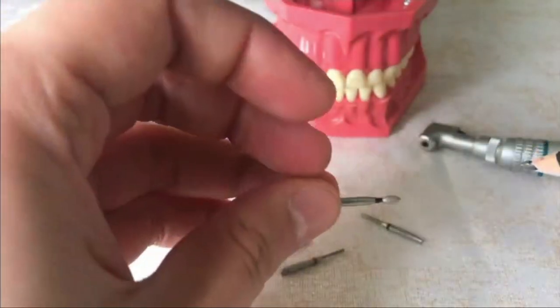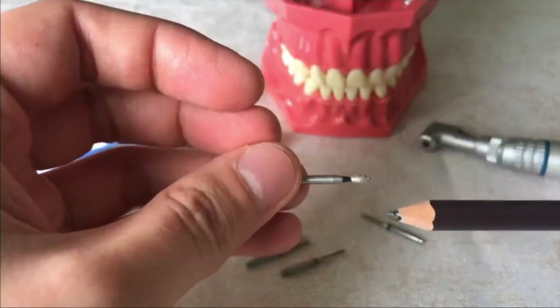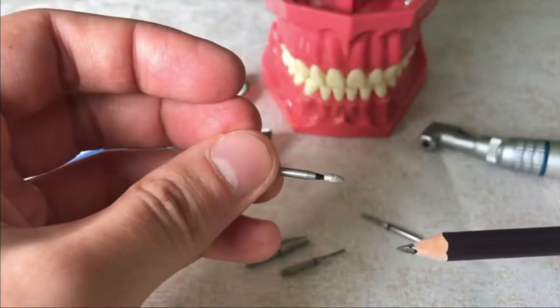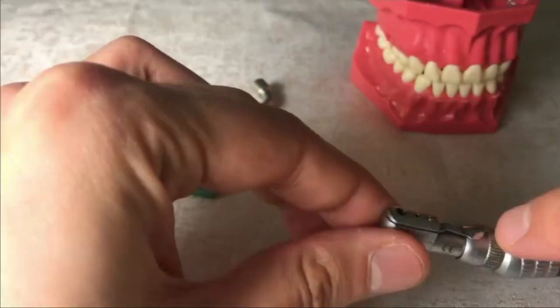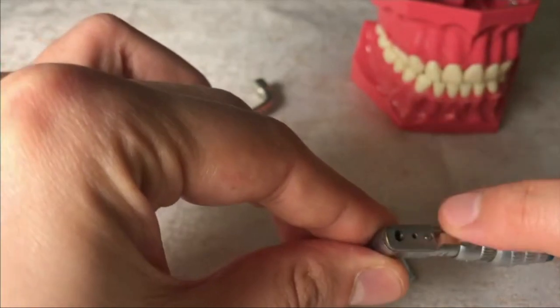Another burr is the pear shaped burr, or football shaped burr. We will use this burr when making the lingual preparation to reduce the remaining tooth tissue above the cingulum. Differently from these, we will use the flame end burr for the reduction of proximal areas.